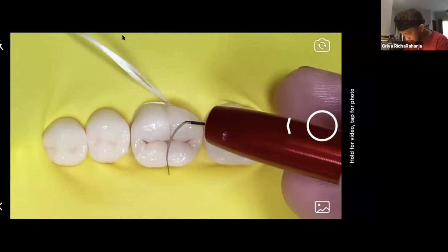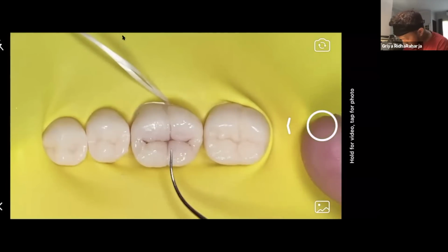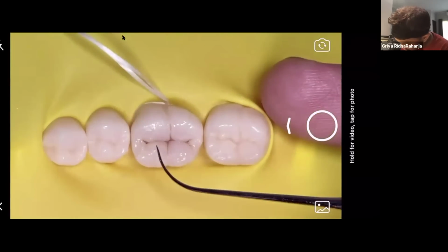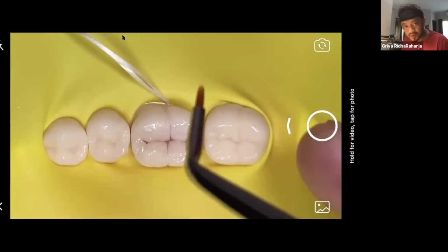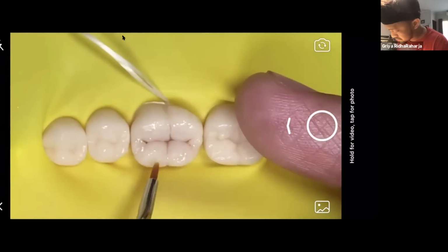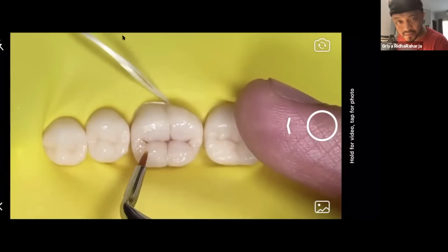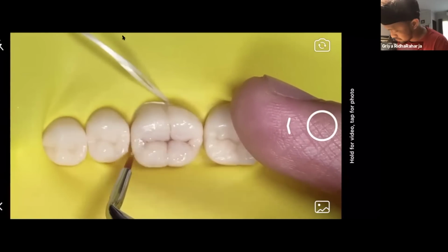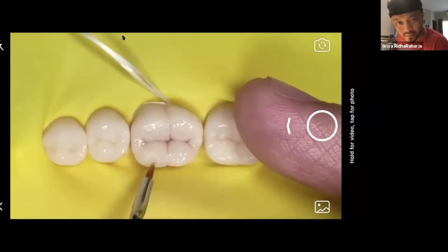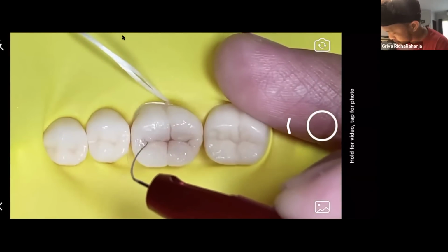And so, okay, now I will make it smooth again with a brush. So for me, I always brush after packing and before you want to cure. I always brush. So that's the secret. Okay, brushing again. Close the gaps. See. And then sometimes the gaps are so close, so we need to make them separate again.